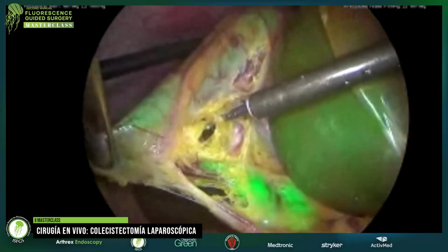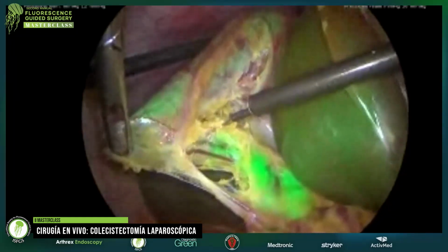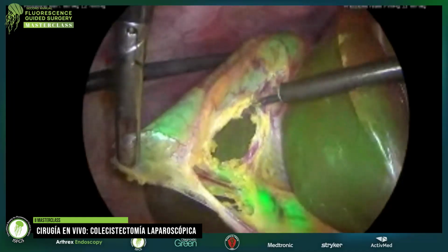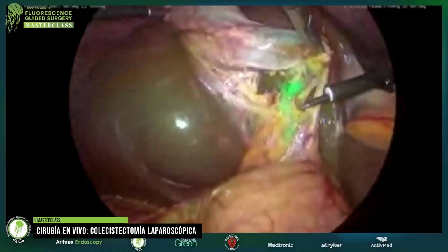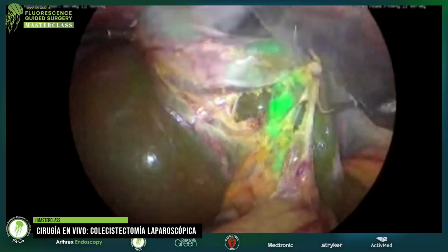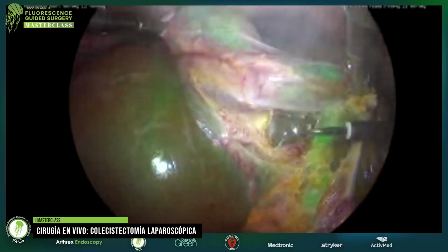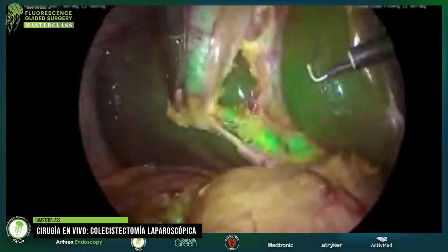So basically, this was obtained when the injection was done 1 hour before surgery. That is something that we all know is the most common thing to do, because the patients usually come in the morning. So we give the injection according to the body weight. Actually, we were on this 1 hour study that Professor Boni was talking about before, with a laser tower, but today we are using the Rubina Storz, which is an LED system. So it is possible to use this kind of low dosage with both technologies, from our experience. Because at the very early stage of our experience, we were probably giving too much ICG to the patient.